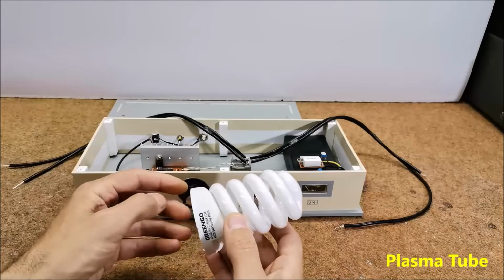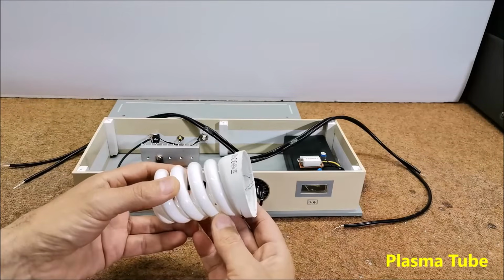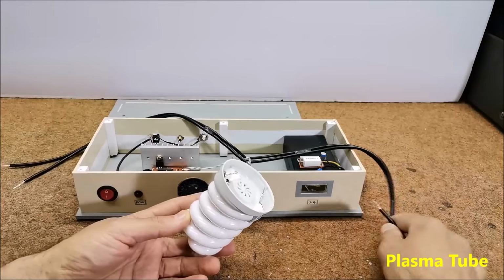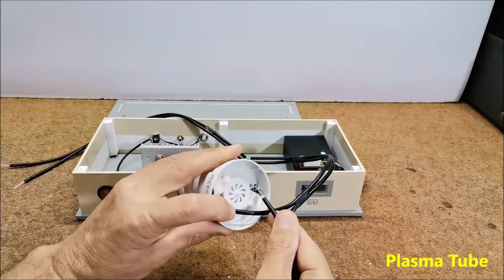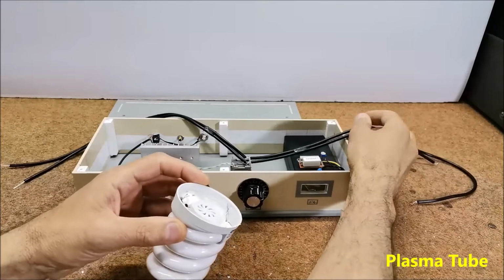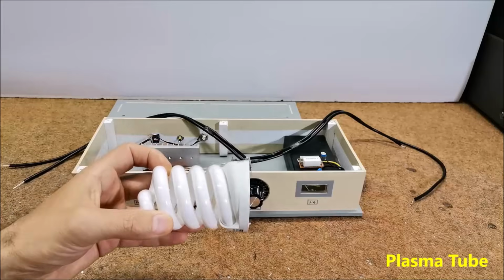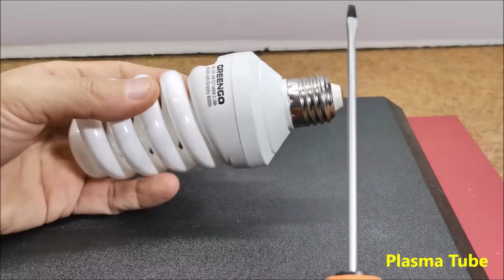This is a plasma tube taken out of an old CFL bulb, and the two wires need to be connected to the secondary of the high voltage transformer. The following is a short video description of how to separate the tube from the electronics of the bulb. We can remove the PCB relatively easily with a screwdriver.